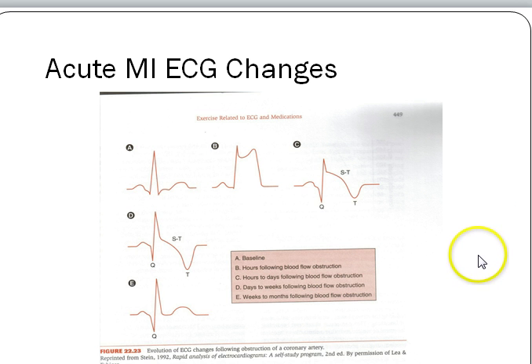They're going to go to the ER and they'll take that very, very seriously. So do know the difference between the normal and what the acute heart attack, myocardial infarction, MI, looks like. Again, it looks very, very different. The ST segment is elevated.